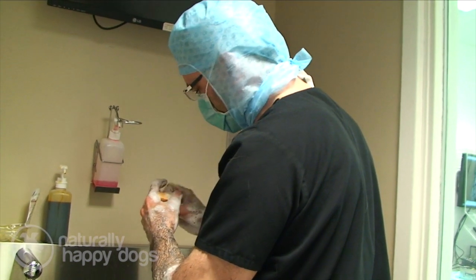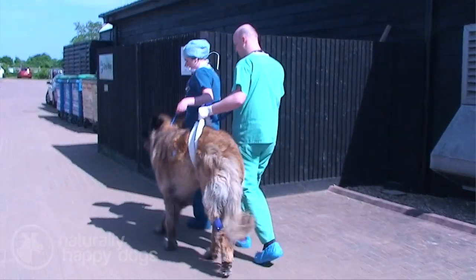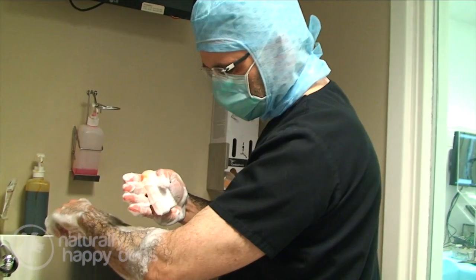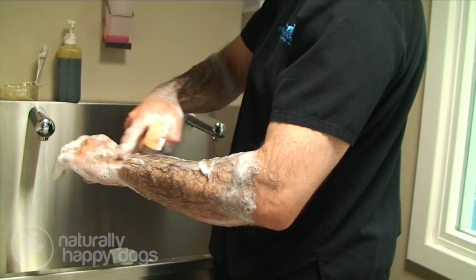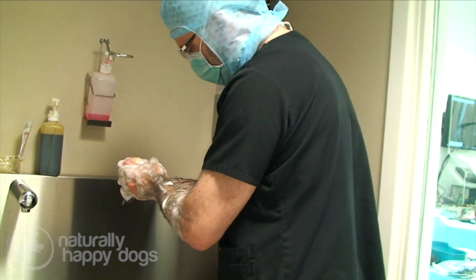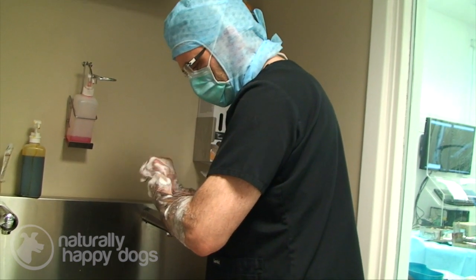What we're going to do is chop the tumour out and replace it with metal. This is a custom made piece of metal designed off of a CT scan. We did a CT scan of his leg and made a piece of metal that's going to replace everything between here and here. We're going to keep the blood and nerve supply to his foot, so he'll still walk on his foot, but everything in between will be metal surrounded by skin. I guess that is the definition of bionic — metal with tissue around it working like a normal bone.